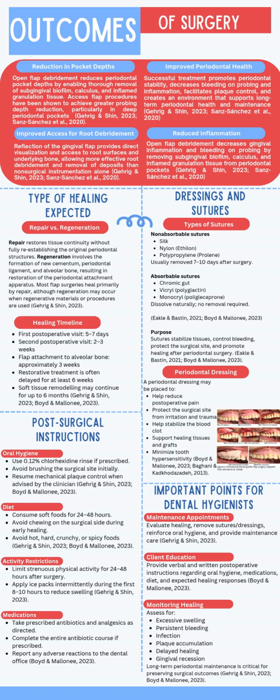And for the outcomes of surgery, open flap debridement can reduce periodontal pocket depth, improve access for root debridement, and decrease inflammation and bleeding on probing. Overall, successful treatment supports periodontal stability, easier plaque control, and long-term periodontal maintenance.